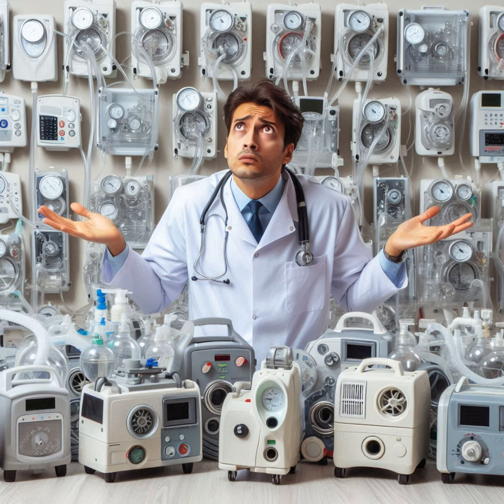Well, they're both incredibly valuable for understanding what's happening at the alveolar level. Esophageal balloon manometry, for example, helps us estimate pleural pressure, which is the pressure surrounding the lungs. So it's like having a pressure gauge tucked right between the lungs and the chest wall, giving us a more accurate reading of how much pressure those alveoli are actually experiencing. Exactly. And volumetric capnography, as we've already discussed, is crucial for measuring alveolar tidal volume, the amount of air that's actually reaching the alveoli and participating in gas exchange. It's like finally having the right tools to measure the ingredients in a recipe instead of just eyeballing it and hoping for the best. That's a great analogy. And the article emphasizes that wider adoption of these technologies is crucial for translating this research into real-world clinical practice. Yeah, it's like having a cutting-edge map, but no compass to navigate with. Precisely.